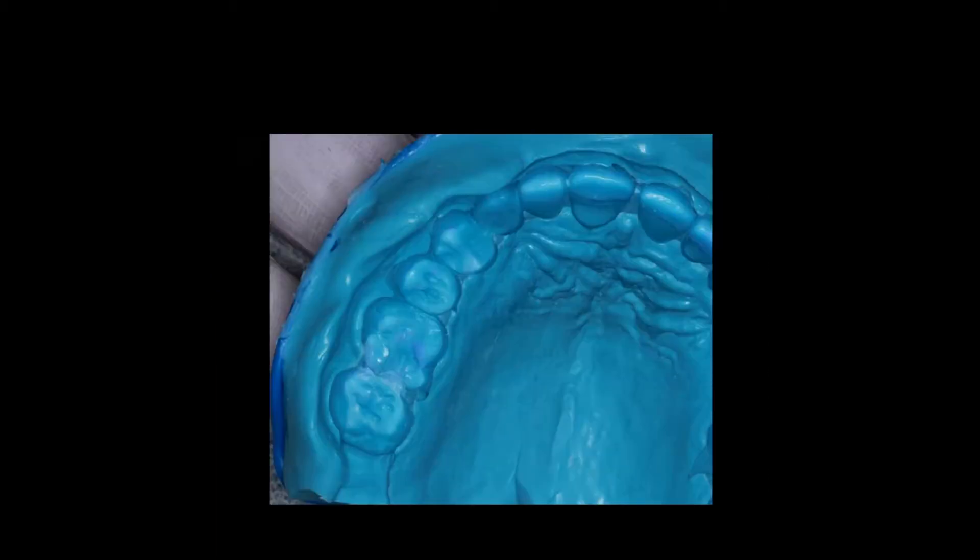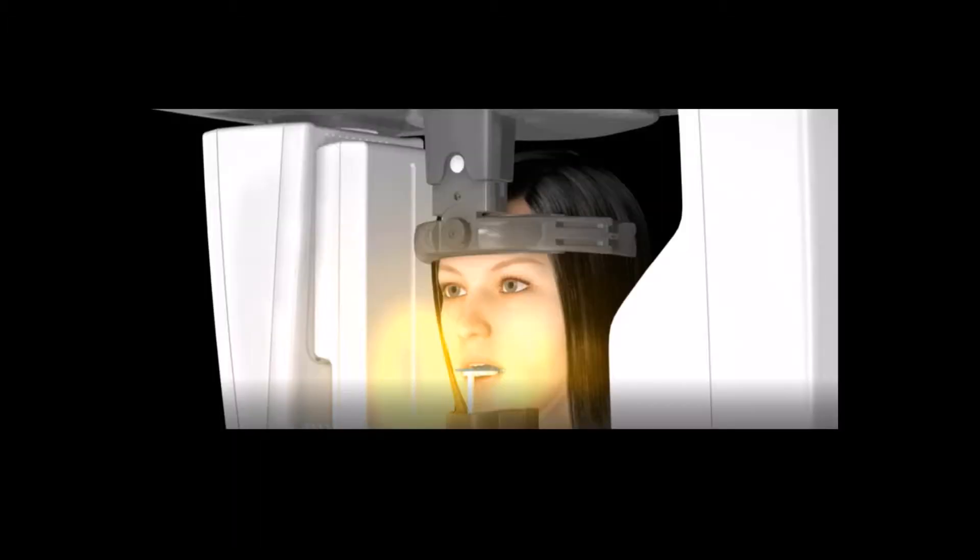Remove areas of excess impression material around the radiographic markers so the radiographic markers are clear and distinct from the impression material. Snip the interproximal areas with scissors and remove to help with reinsertion. CT scan the patient with the impression tray in their mouth. It is recommended to use cotton rolls between the impression tray and the opposing arch to ensure full seating during the CT scan.